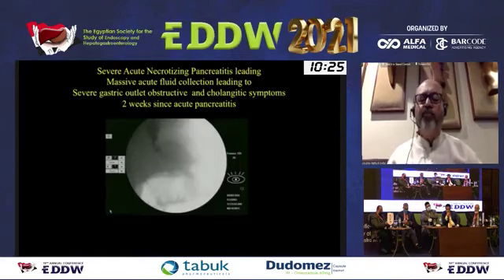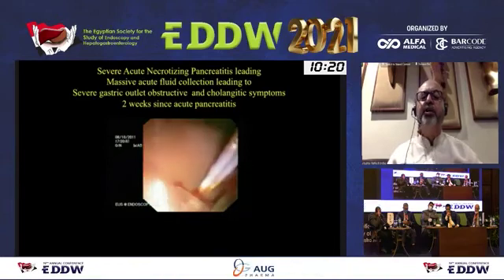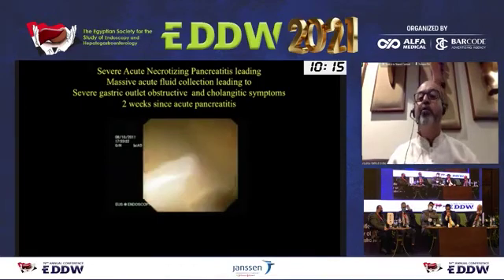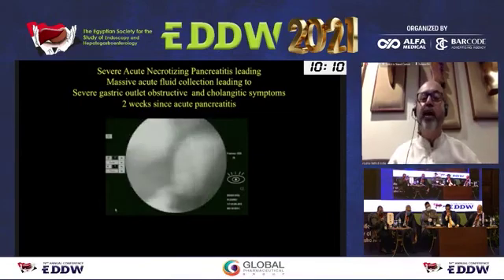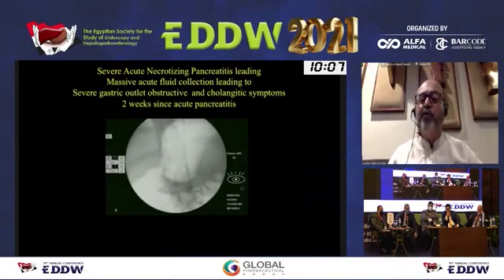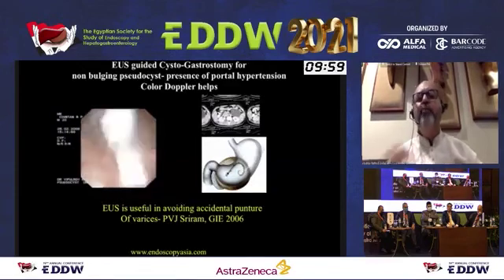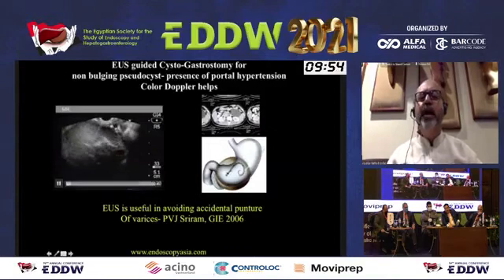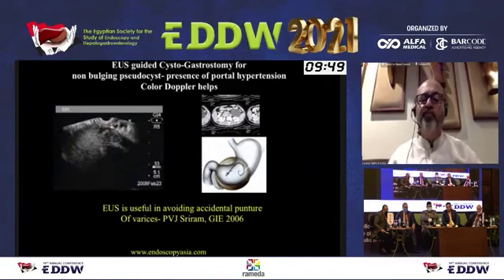When you have a very thin wall of the fluid collection, you don't do any balloon dilatation, or only minimum dilatation, do your stent placement, and leave a nasocystic catheter for control of aspiration of the fluid. That takes care of this patient even within 2 weeks of acute severe necrotizing pancreatitis with a large fluid collection. Look at the size of the stent I have placed inside. This is something which has changed our perception. And of course, with the help of color Doppler, any vascular structures in between can be managed with color Doppler guided interventions, and we can drain the fluid collection.